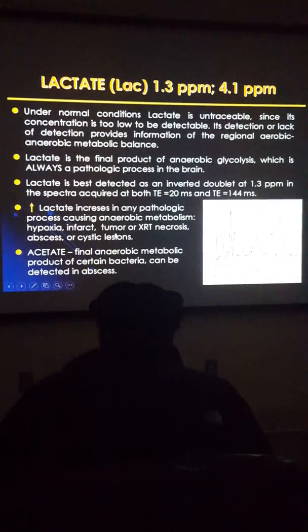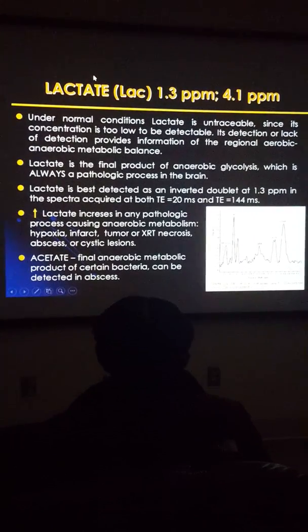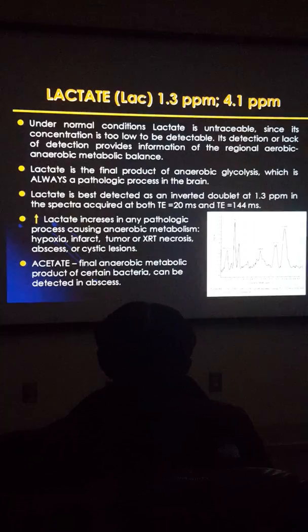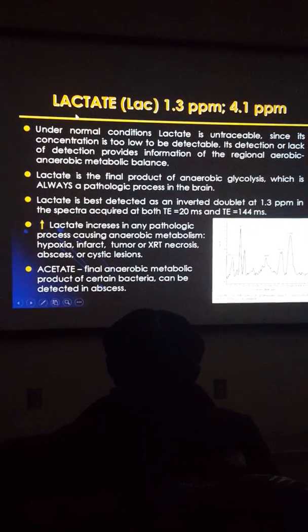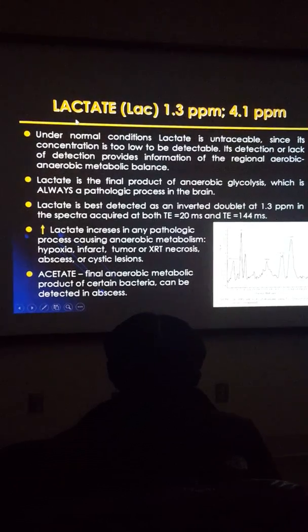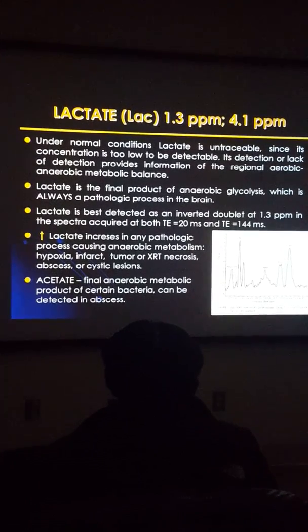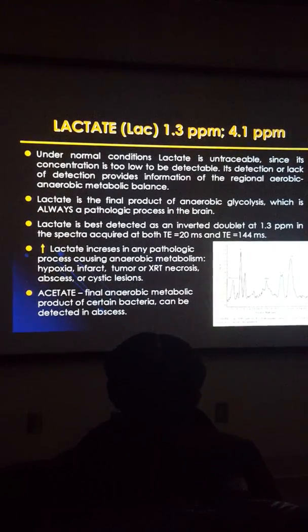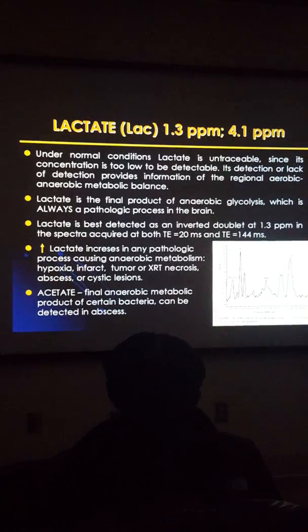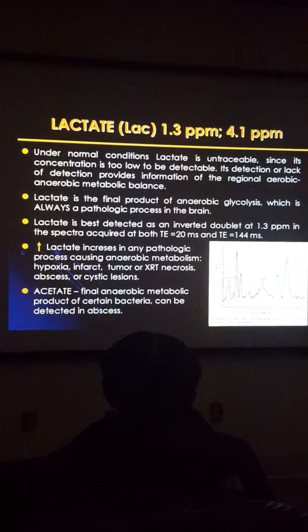If you're dealing with a tumor, you're going to see elevation in lactate and elevation in choline. If you are dealing with radiation necrosis, you're going to see elevation in lactate, but the peak for choline is going to be suppressed because there is no cell membrane production. Aggressive tumors typically are going to be marked by an elevation in choline.